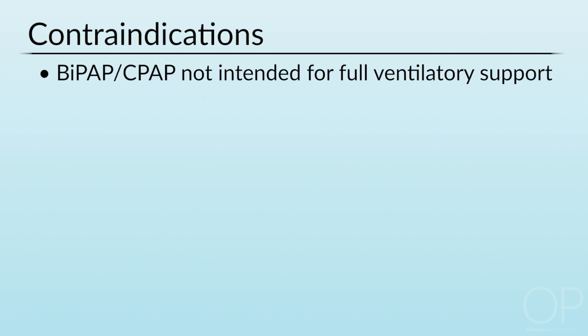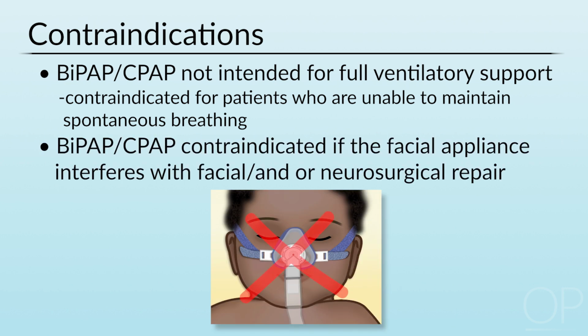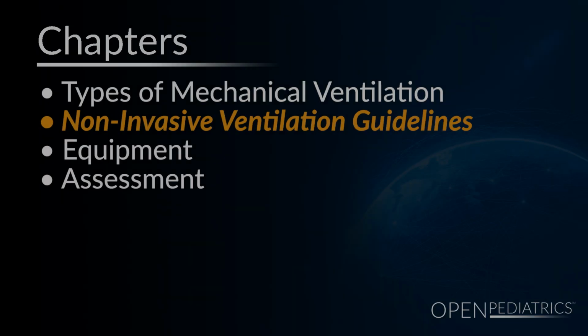BiPAP is not intended for full ventilatory support. Your patient must have some spontaneous effort. BiPAP or CPAP is contraindicated for facial appliances that interfere with facial or neurosurgical repairs.